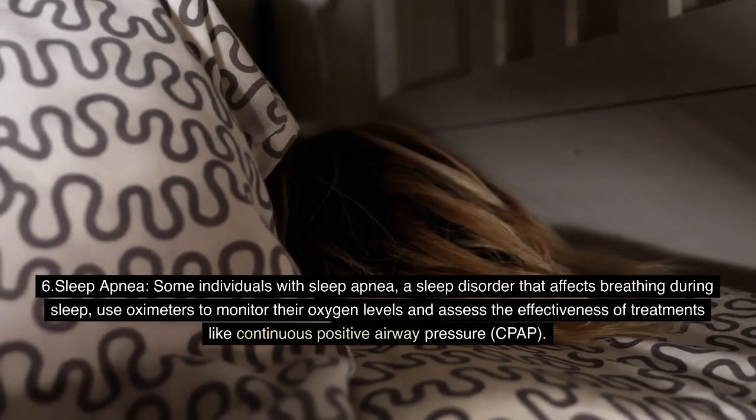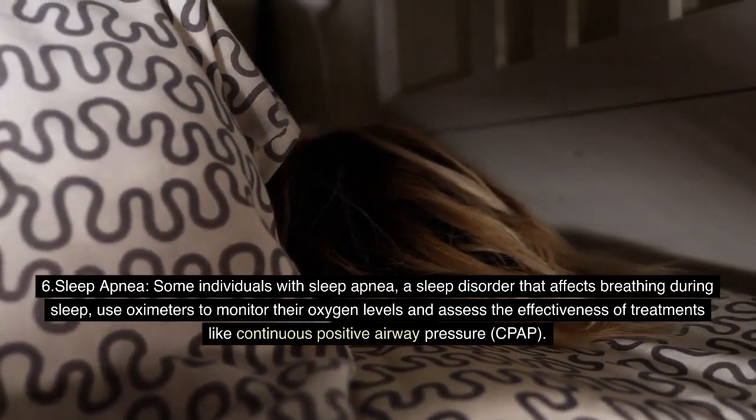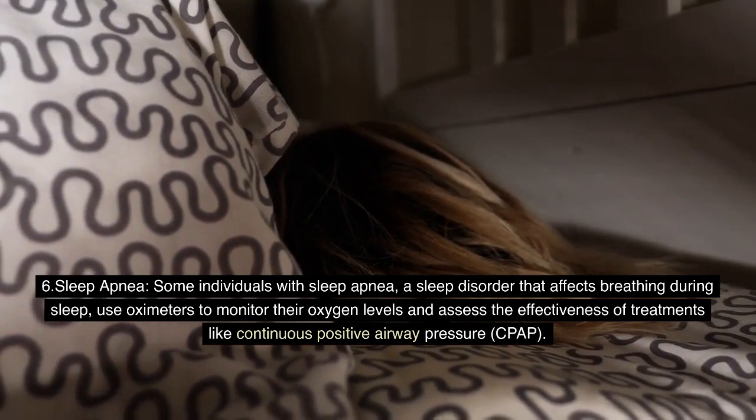6. Sleep apnea. Some individuals with sleep apnea, a sleep disorder that affects breathing during sleep, use oximeters to monitor their oxygen levels and assess the effectiveness of treatments like continuous positive airway pressure (CPAP).